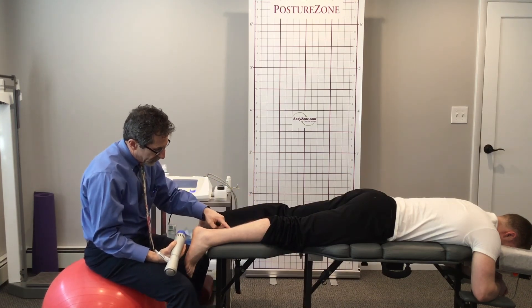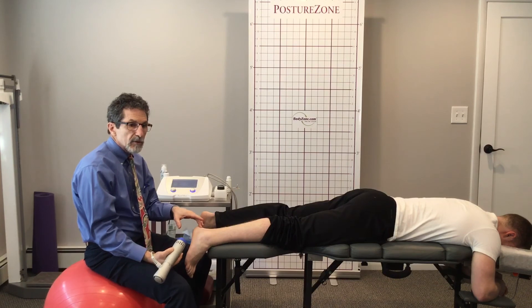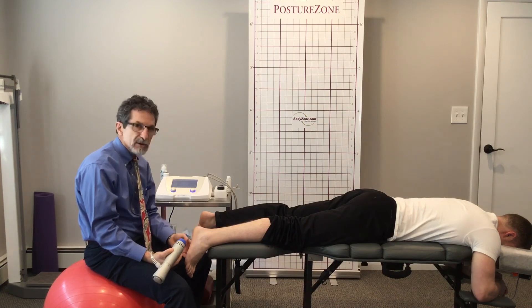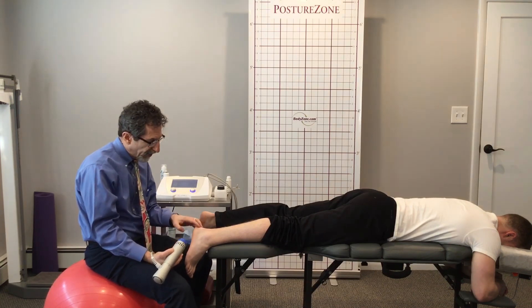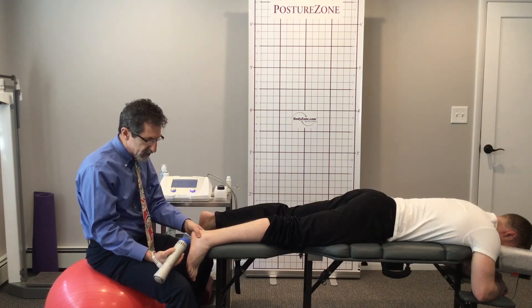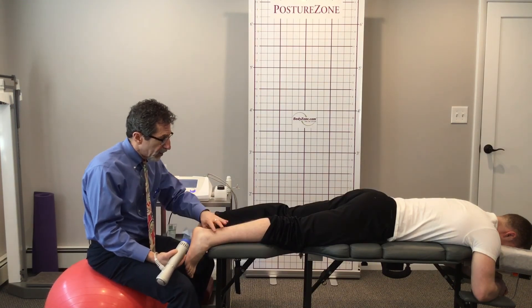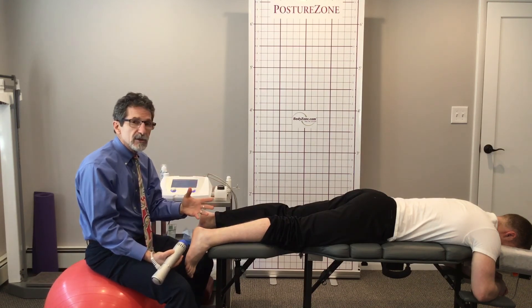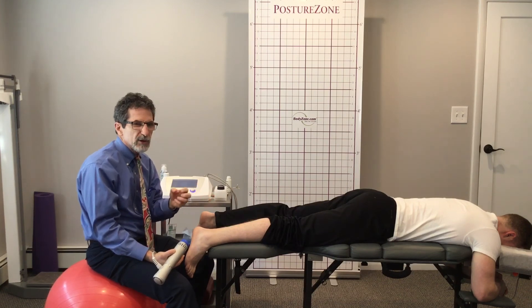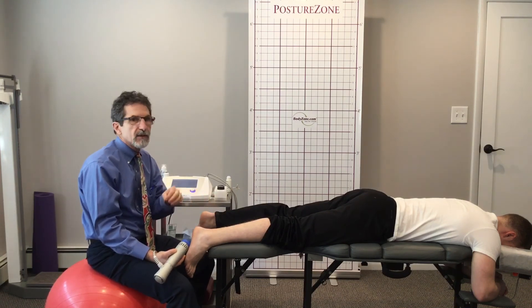We'll hit the gastroc, probably do the soleus through here, and we'll work the plantar fascia. Again it'll be a little sore; however, the soreness may last one to three days. Once the soreness goes away there'll be less irritation to the tissues. We can follow this with some gentle stretching and light exercises as long as there's no real pain. I'll still often use my tape job shown in the other video — that's for acute pain control. We have other settings for healing and other settings for breaking down deep knots. When people come in and can barely walk, we find this gets them over the hump.